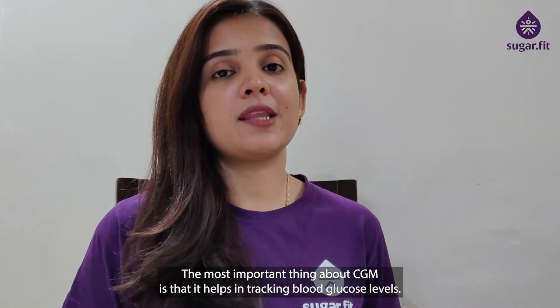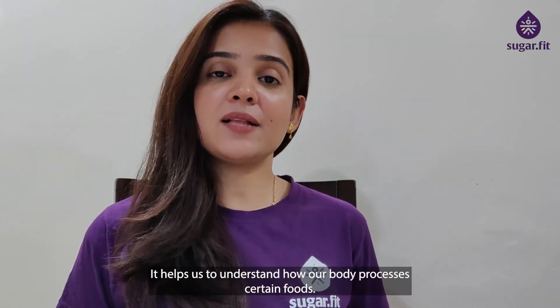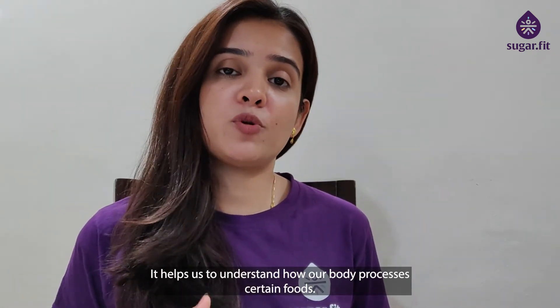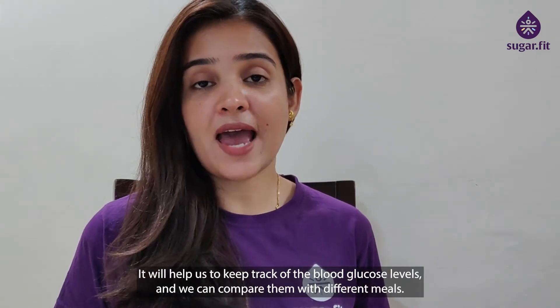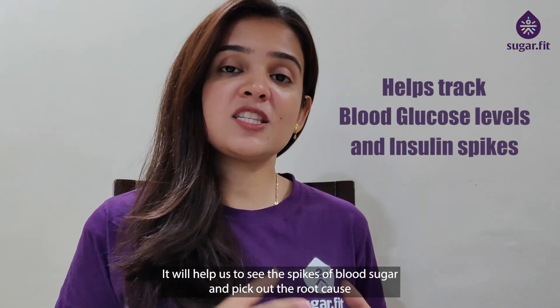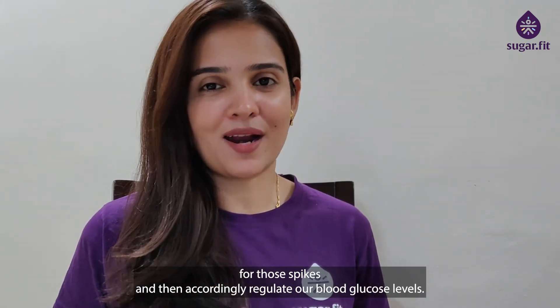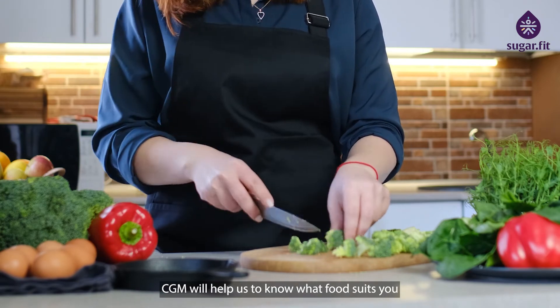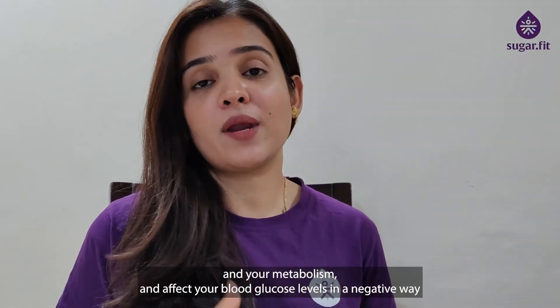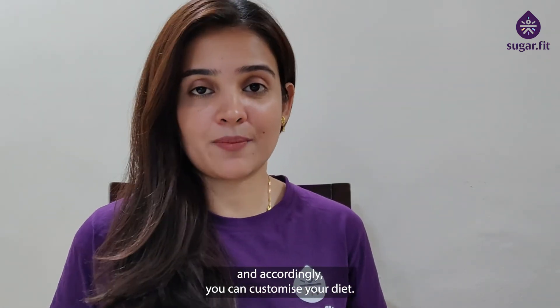The most important thing about CGM is that it helps in tracking blood glucose levels and helps us understand how our body processes certain foods. We can compare blood glucose levels across different meals, see the spikes, and pick out the root cause for those spikes to regulate blood glucose levels. CGM will help us know what food suits your metabolism and what affects your blood glucose levels negatively, so you can bring in customization in your diet.